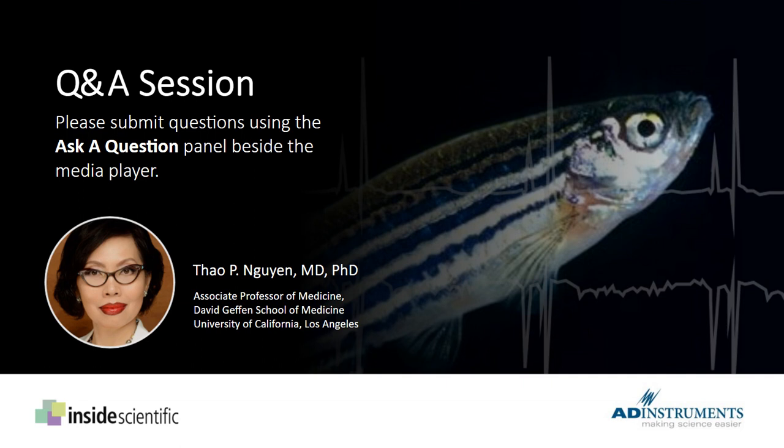Oh, very good. And I went over that briefly in my notes. And how do we know that that is the most optimal? Well, by trial and error, by practicing it. And the best time to fix things is live interpretation. Once you are set and ready to record, as soon as you record, you analyze it, you interpret it live, and you look at the ECG tracing and you see, is it good? Is it good? Voltage signals? If it is not, if you think that it is too small amplitude, then you readjust the positioning right away.